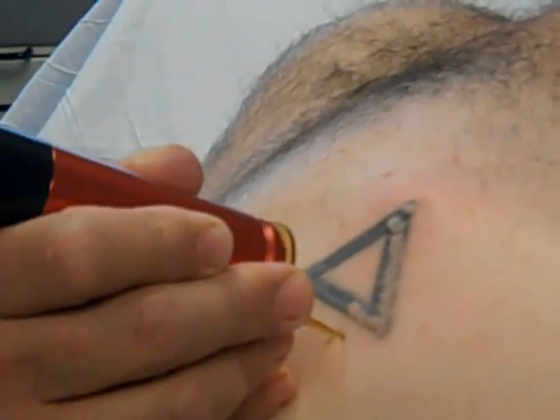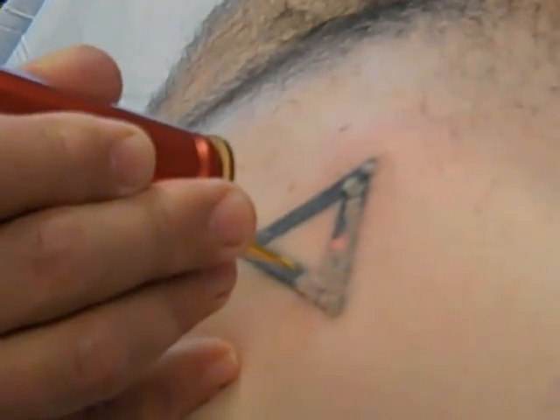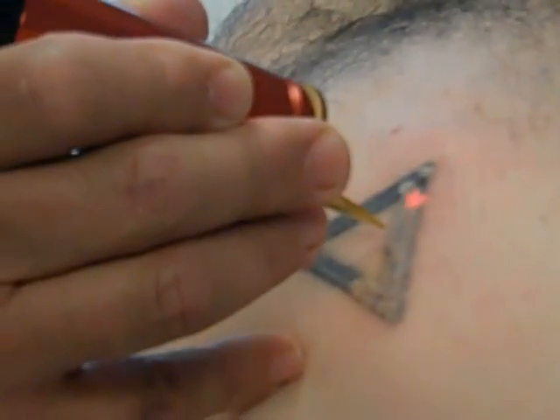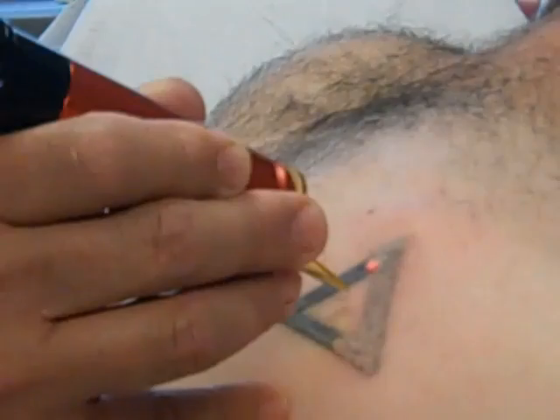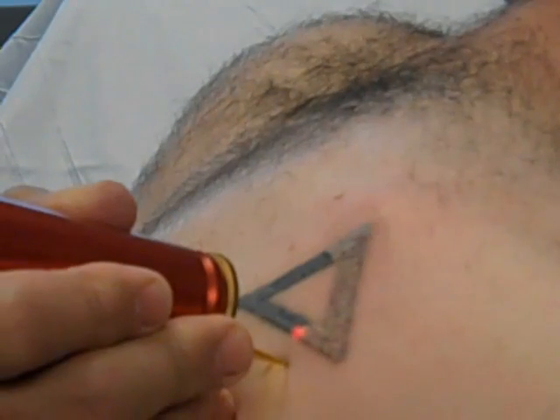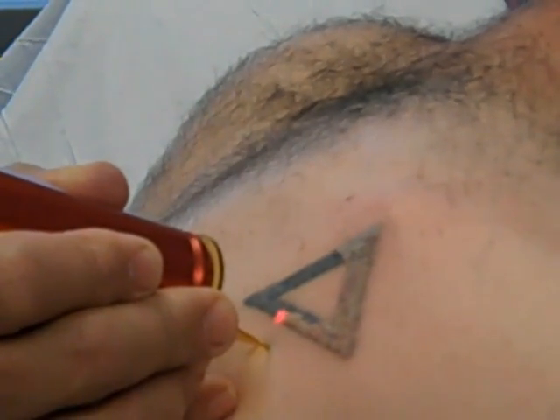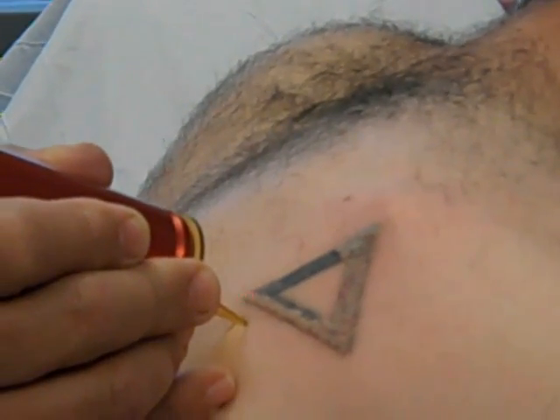This is a 3mm spot. We can go up to a 4mm spot with this, down to 2mm. We're going to give the patient a rest here because I can see it's bothering him a little bit despite the fact that we put topical on. Nearly done. We have topical anesthetic on underneath cellophane for about 15 minutes. It's still a moderately painful experience.